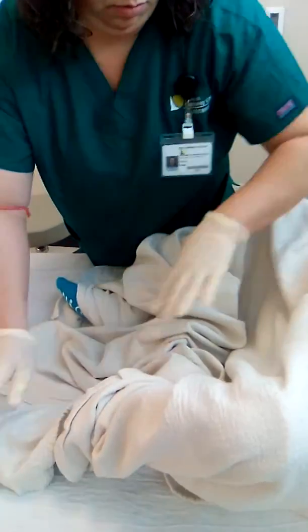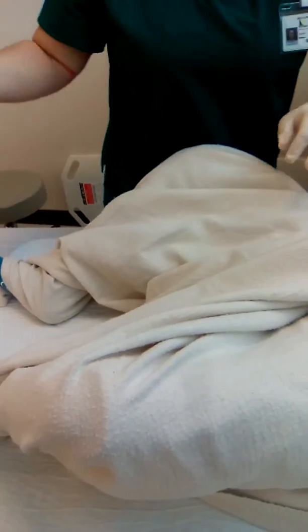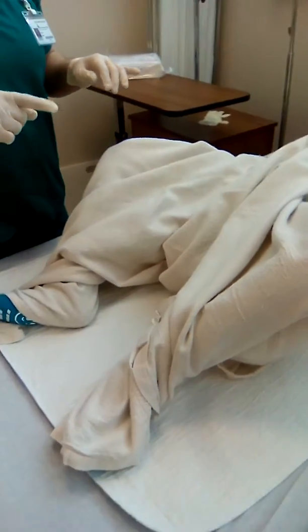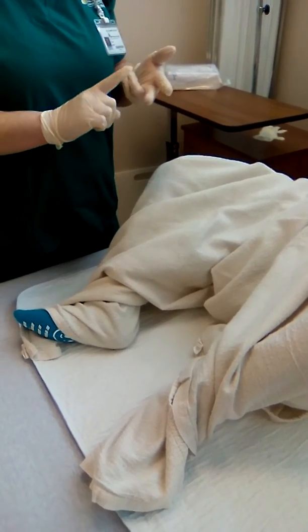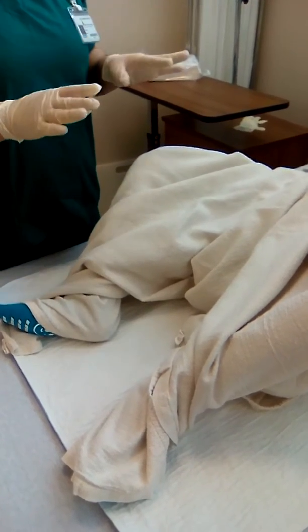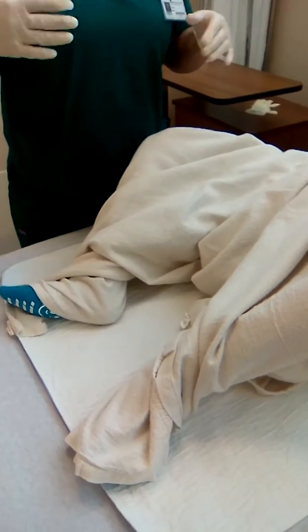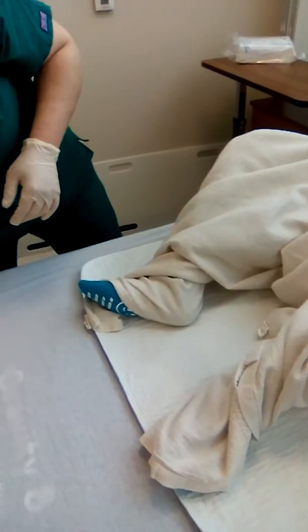I will position the light to illuminate the genitalia so that I can note any anatomical landmarks. I will note for any erythema, drainage, odor, discharge, and I will note the placement and position of the urinary meatus. And if the light is not close enough, I will have my assistant help with the light.